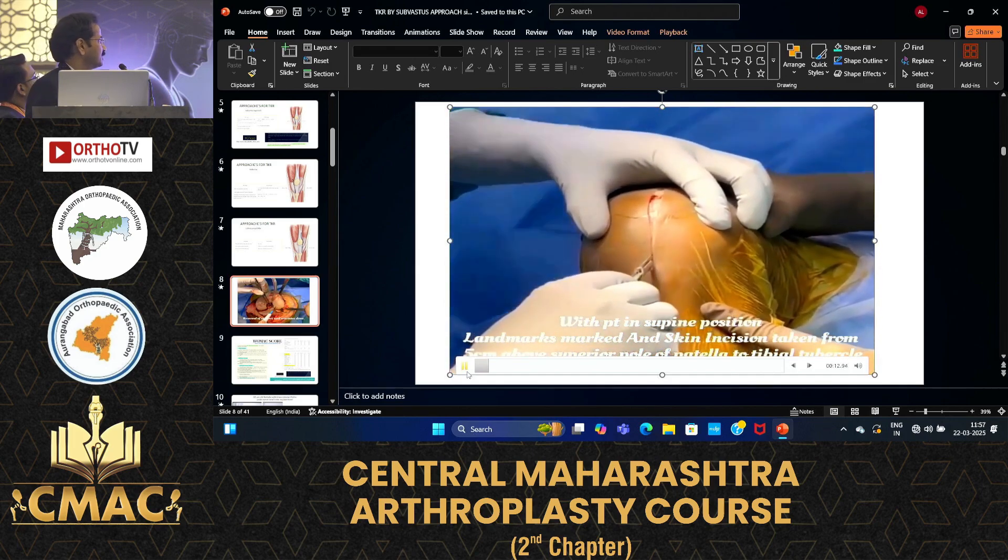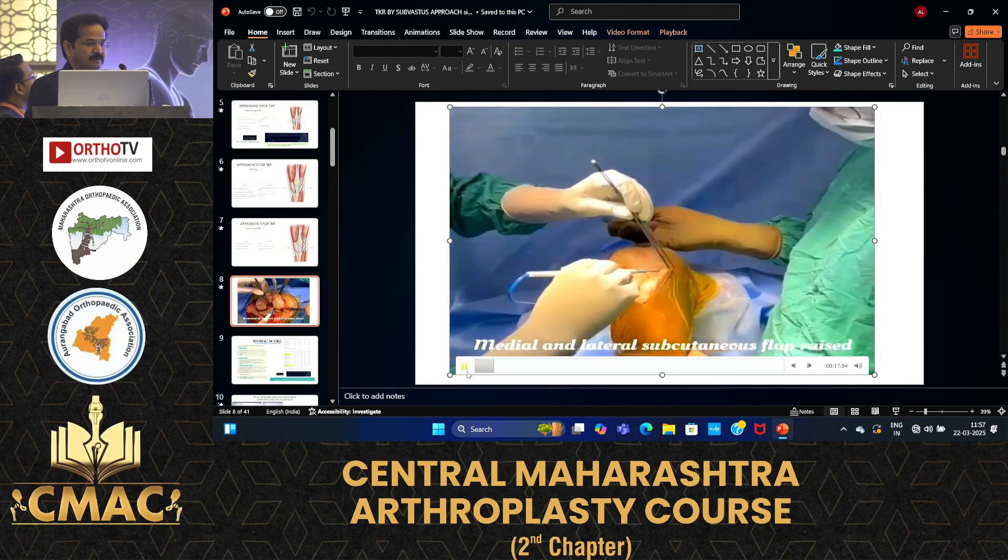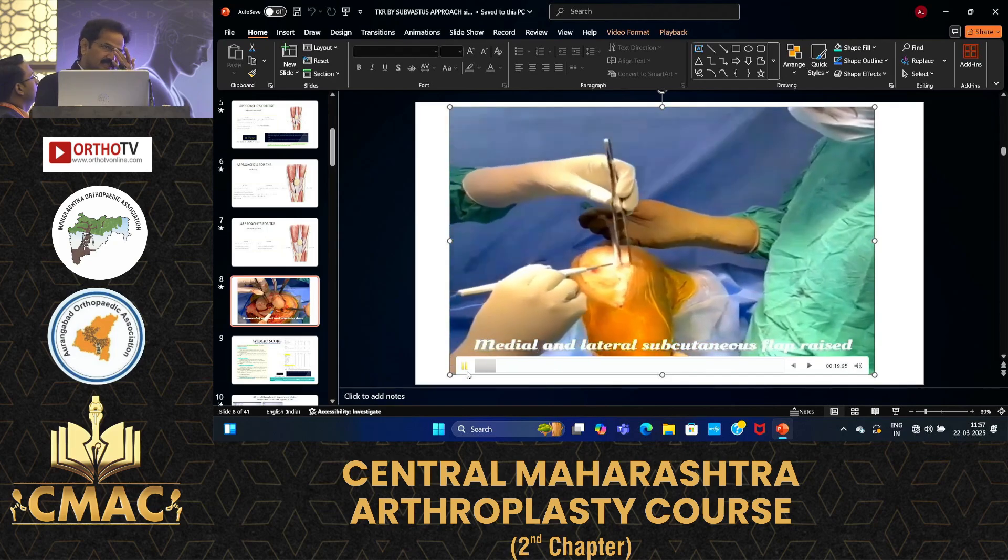First, mark the incision from the supra pole of the patella to the tibial tuberosity. Then make the medial and lateral dissections.